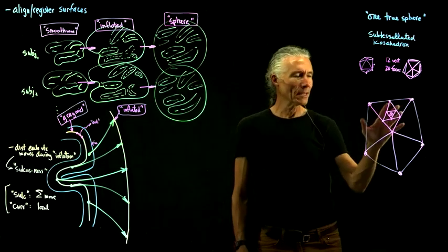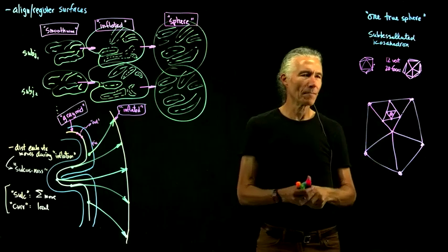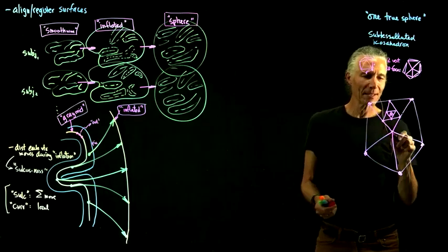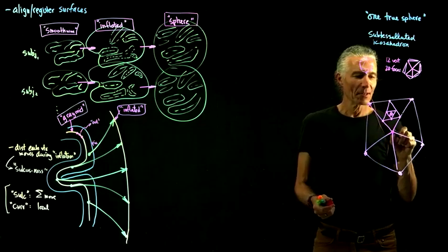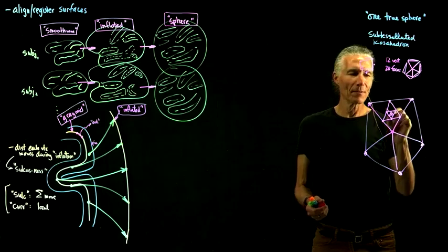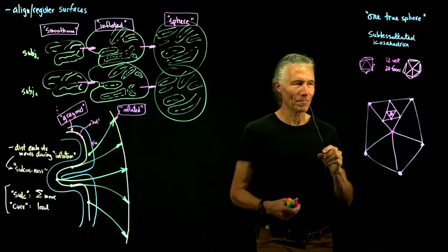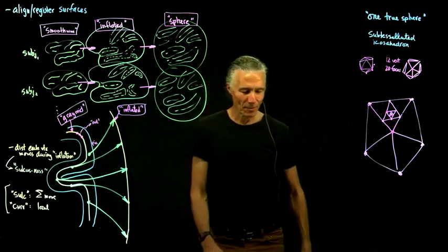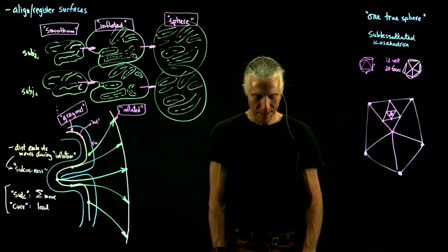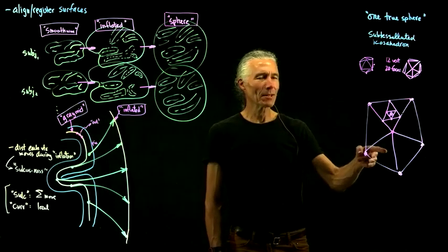Each time you promote everybody out to a sphere, so you end up with an estimate of a sphere. It's a slightly weird kind of thing, because you notice that there's 12 vertices that have only 5 faces around them, but then every other vertex has 6 faces around them. So it's slightly asymmetrical. There's a couple special vertices, and if you go to one of those space theaters, Omnimax theaters, this is what the screen looks like.